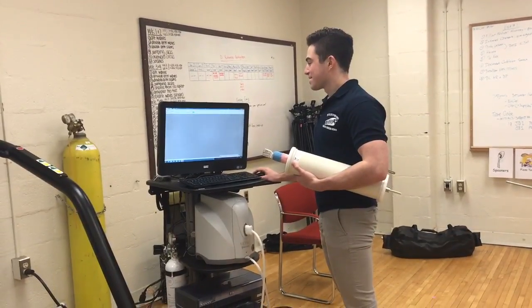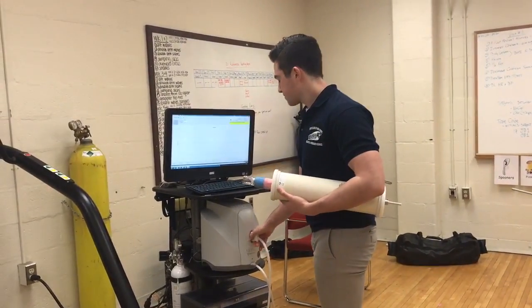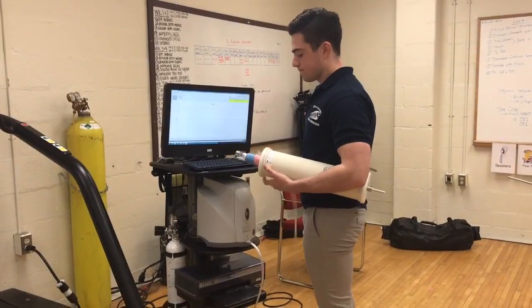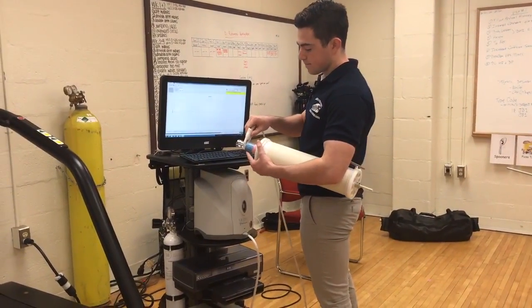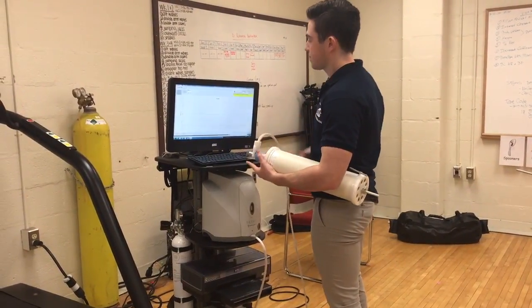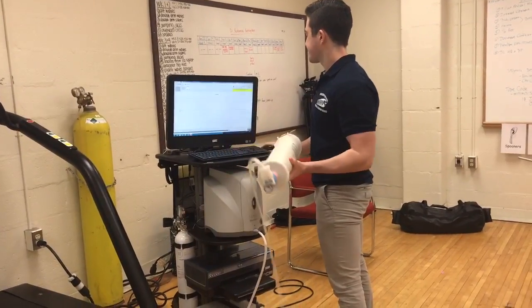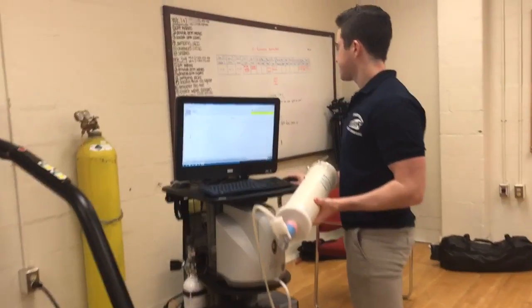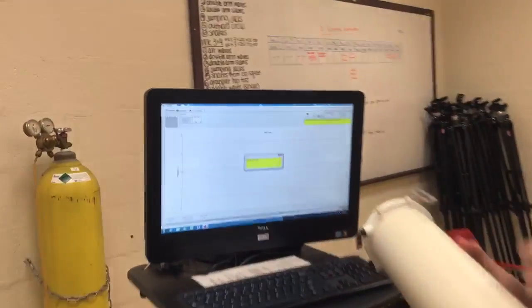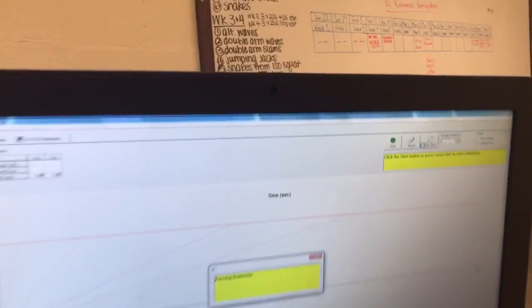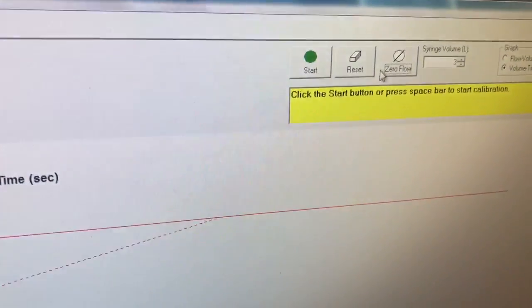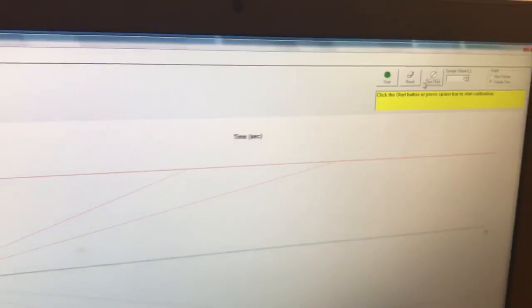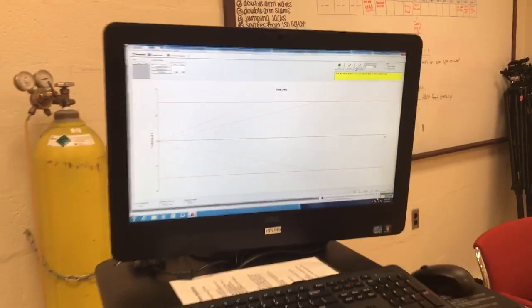Once the vac is complete, unplug the umbilicus from the cart and plug it into the end of the syringe with the ridge facing outwards. Click calibrate and then click zero flow on the top right. After the cart zero flows, you're ready to start calibrating.